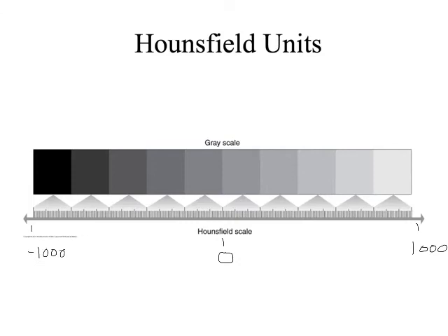So out here, we've got black. Black is black, right? And over here, we've got white is white, right? The black stuff on an X-ray. What shows up black on an X-ray? Air. Thank you. So air. Air in the world of Hounsfield units is like negative 1,000 Hounsfield units, right? What shows up really white on my X-ray? Bone? Yep, bone. So this is where we got the grayscale from.